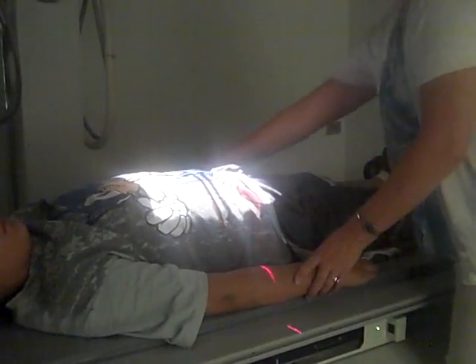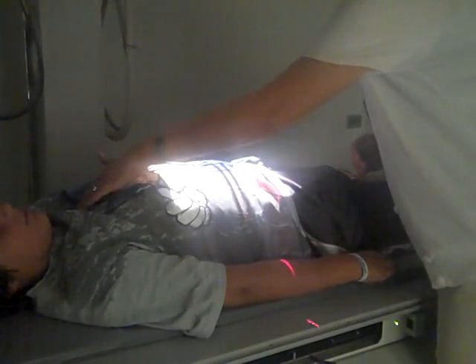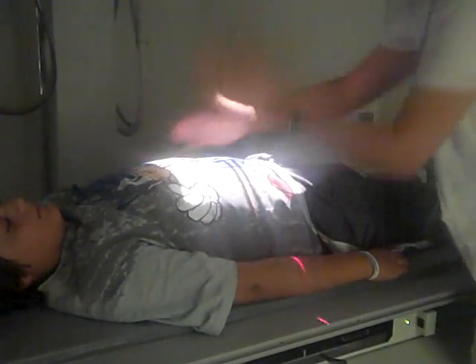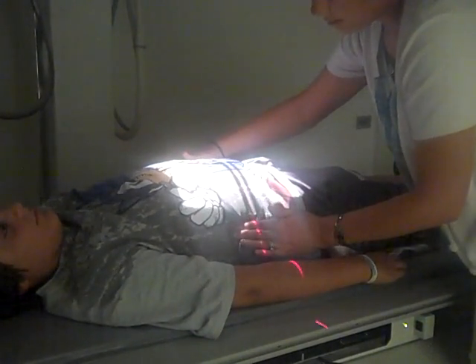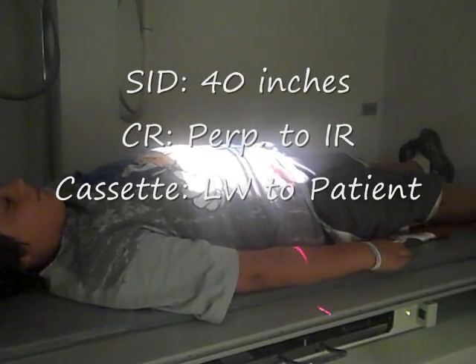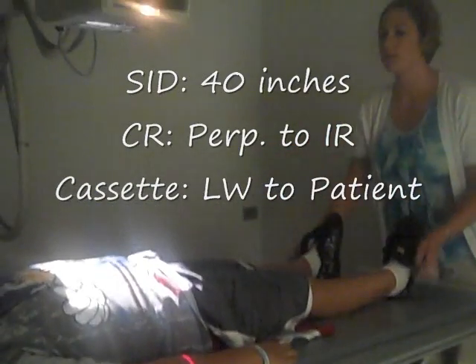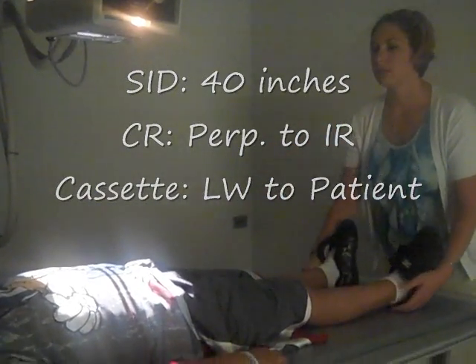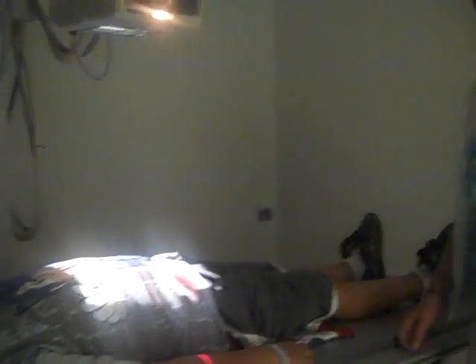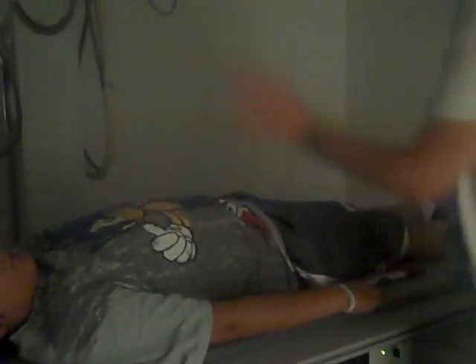I want to make sure that their arms are not in the light field. If I feel my patient's sternum I can see that I'm right down the middle. Feel for the top of the crest, and then always go to the head or to the foot of your patient to make sure that you are right down the middle and that your patient is nice and straight. Make whatever adjustments you need to make sure that it's right down the center of your patient.